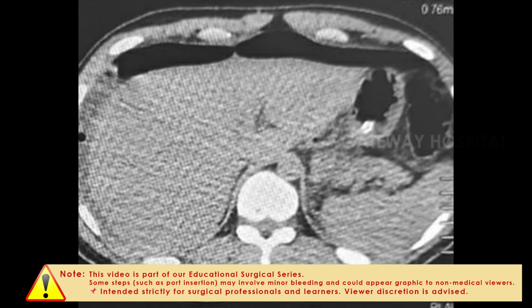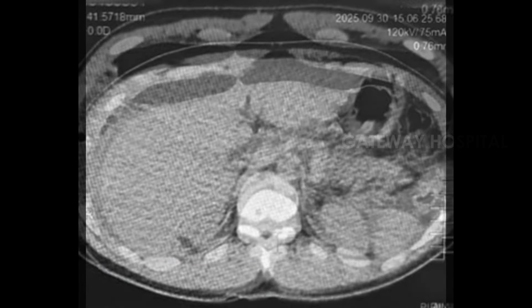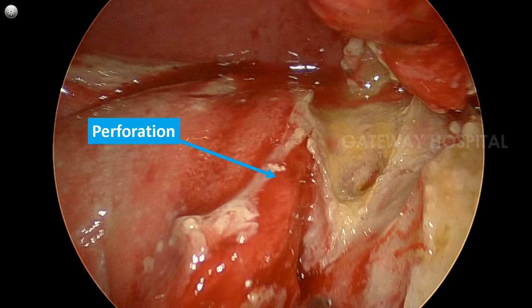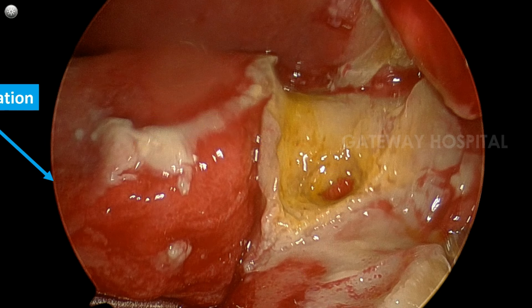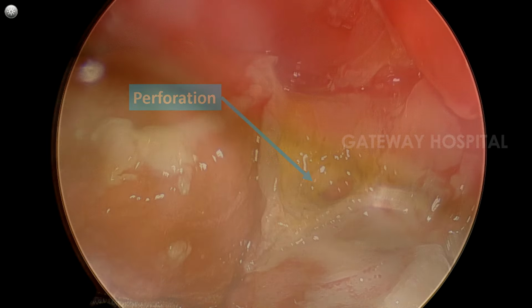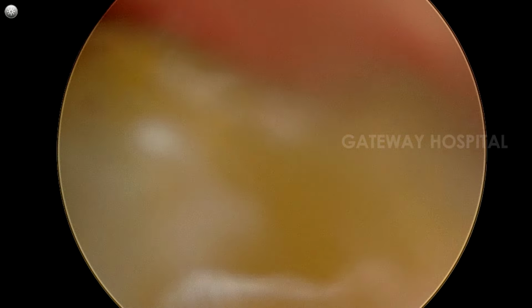The laparoscopic entry is very important, so you have to use Palmer's point entry. Normally, if you are going through the umbilicus, then invariably you will be entering the bowel loop. So you have to enter very carefully through Palmer's point. That too, you should not insert the trocar too deep inside. It can cause perforation to the stomach or the colon.